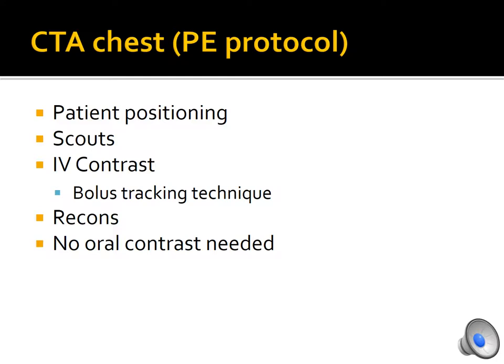The scanner will take low dose images of the region of interest, which is going to be the pulmonary artery, about just below the carina, until contrast reaches the desired location. Then the scan is going to begin, and for this patient, the scan is going to go from lung bases to lung apices in a single breath hold. Now, because she's short of breath, it helps going from the bases to the apices to reduce any motion artifacts.